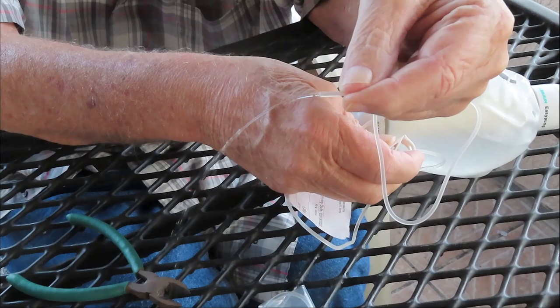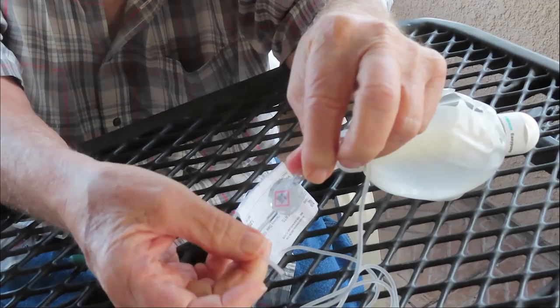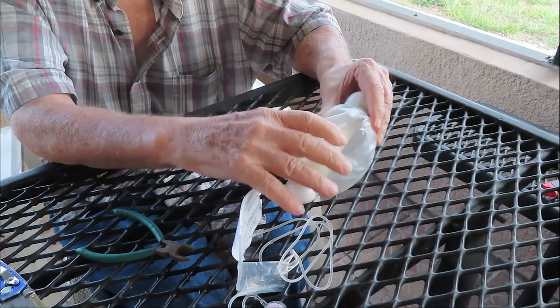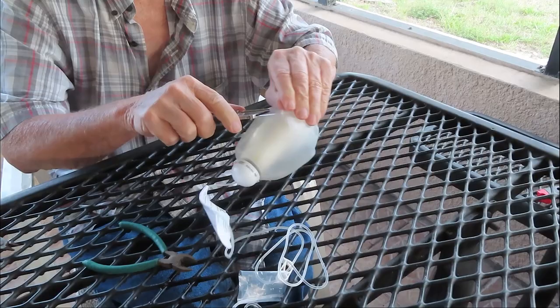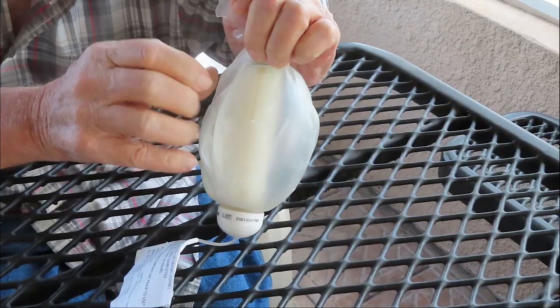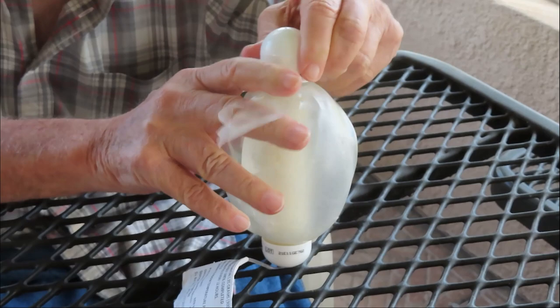Okay, I turned off the valve here. So that's what controls the drip and hopefully gets any remaining air out of it, which is inside of this. So that means this ball has lots of pressure in it still. And that's why it keeps it pressurized. Now, inside the tube, in the middle here, I'm not absolutely sure exactly what's in that PVC pipe. Because we know from the lid where they fill it, it's got to be a check valve and other things in there.